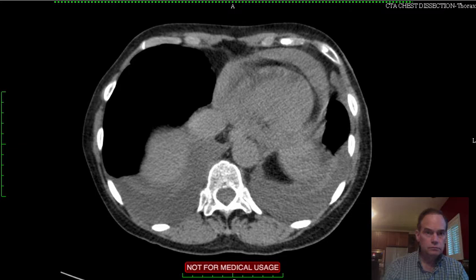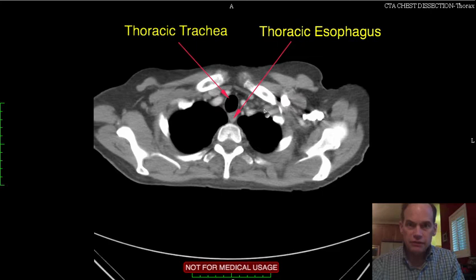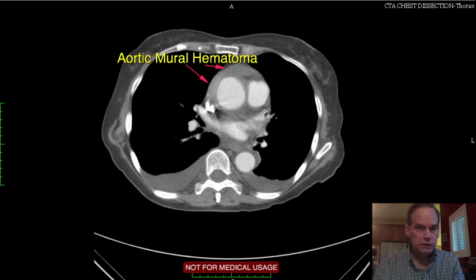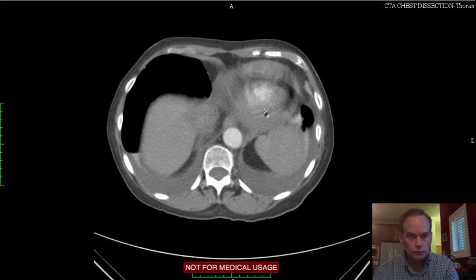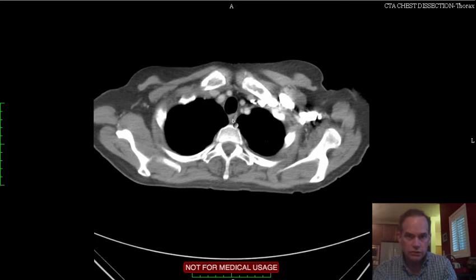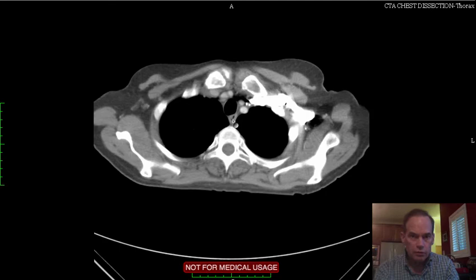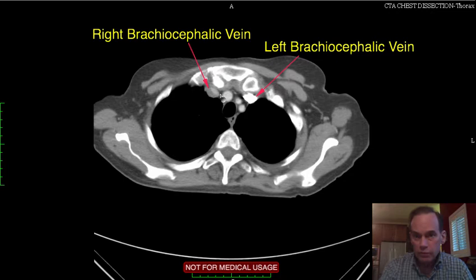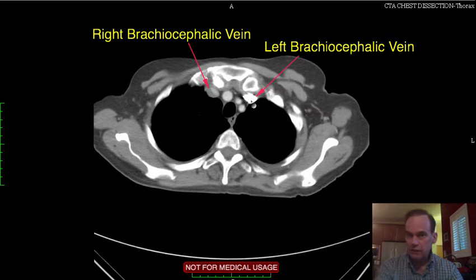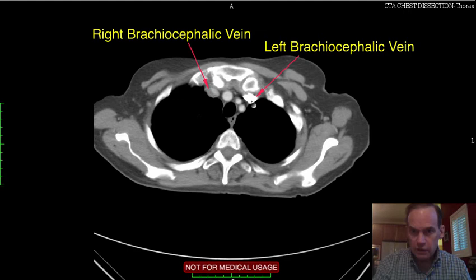Here are the contrast opacified images. Starting at the top, we have the thoracic trachea and the thoracic esophagus — the esophagus is posterior to the trachea in the chest. Up here are the venous vessels: the right brachiocephalic vein and the left brachiocephalic vein. You can tell the patient was injected in their left arm, the left brachiocephalic vein being quite opacified by the IV contrast. That would make this the brachiocephalic artery, the left common carotid artery, and the left subclavian artery.